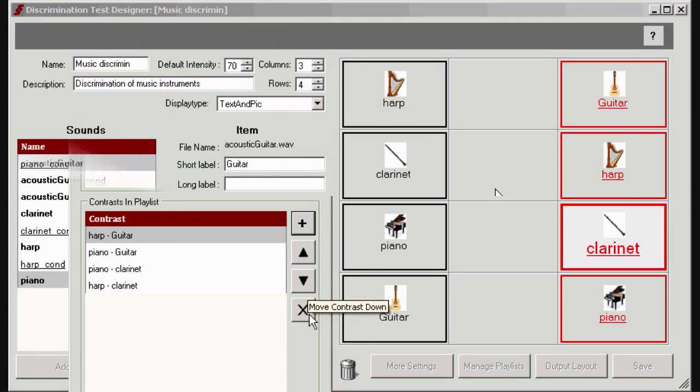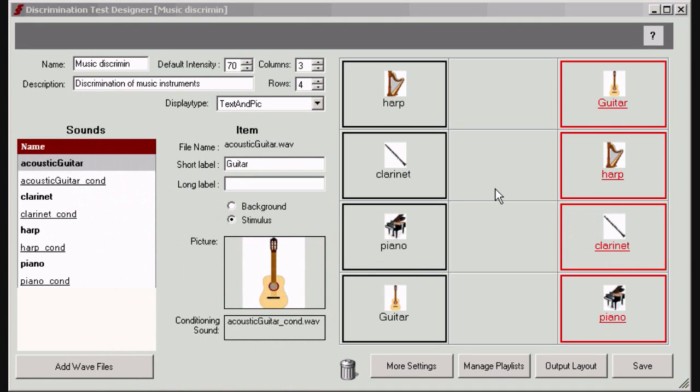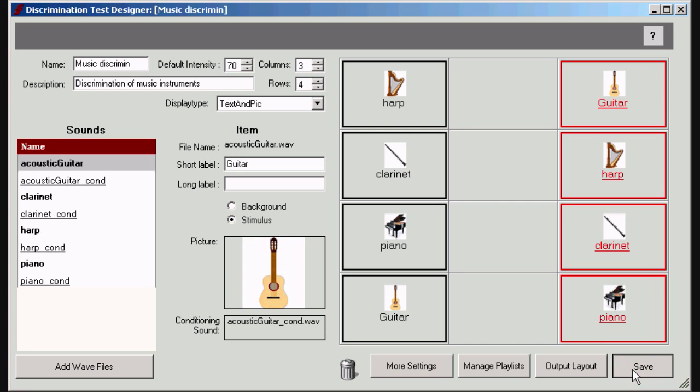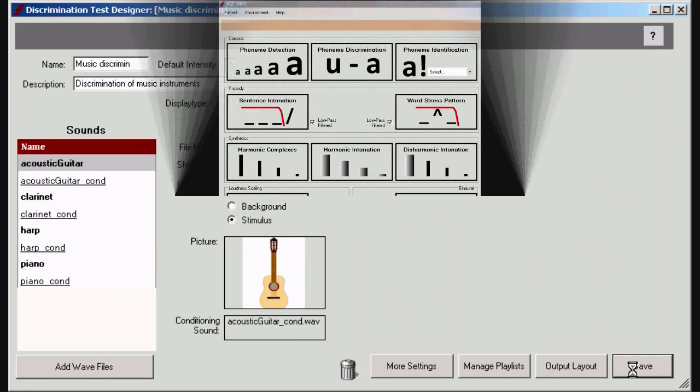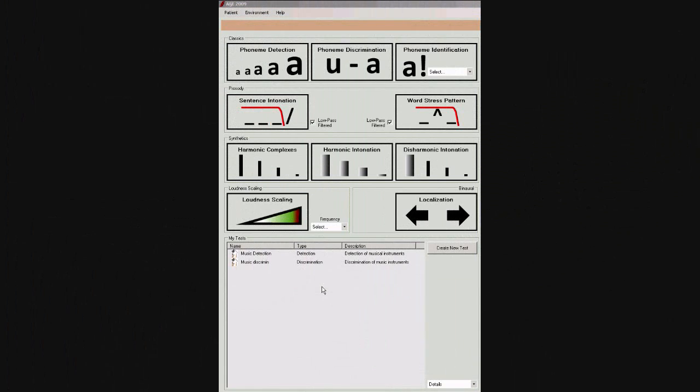Press the save button to save the test and return to the main screen. Please be patient. The saving of the new test can take a while. Your new test appears in this window and is available to be used.